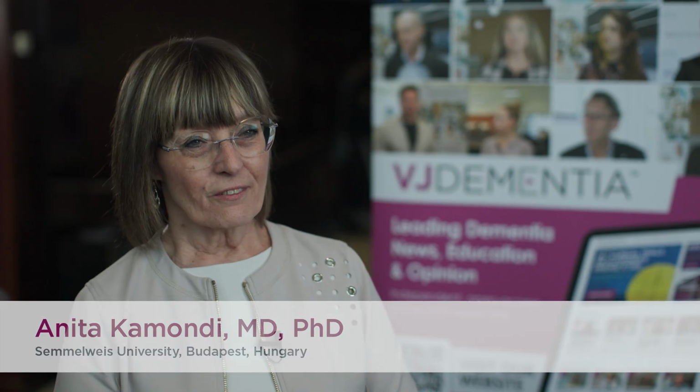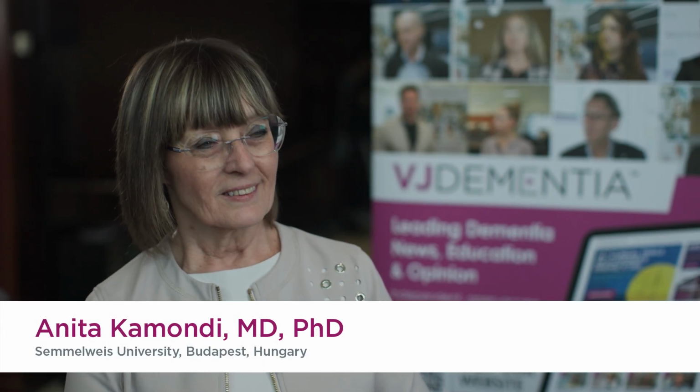The EEG alterations are tricky. There are very evident signs of hyperexcitability on the EEG, like spikes or sharp waves or spike and waves. All neurologists, especially epileptologists, are aware of these signs. Easy to find them, easy to identify them on the EEG. So those are the evident signs of pathological hyperexcitability.